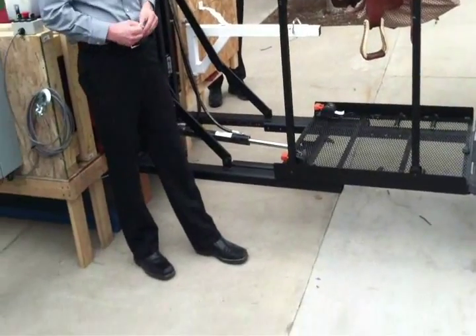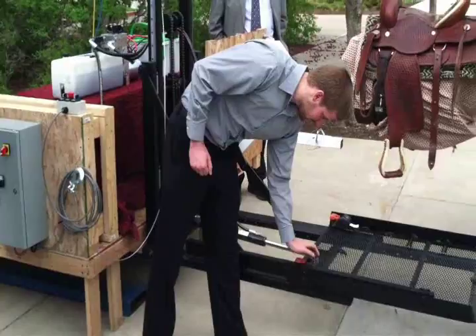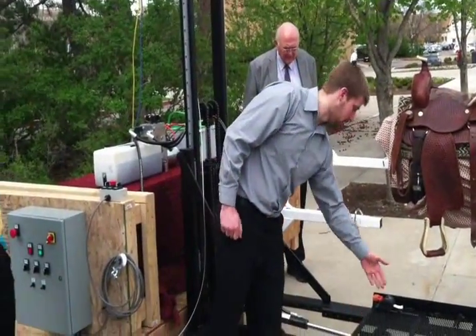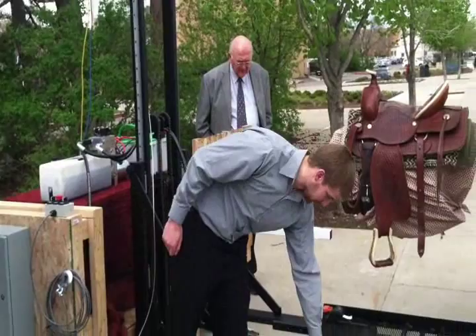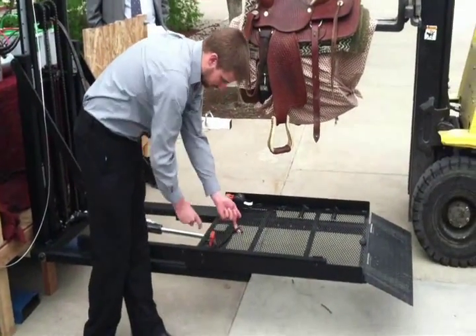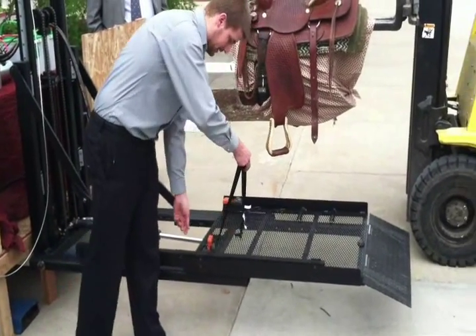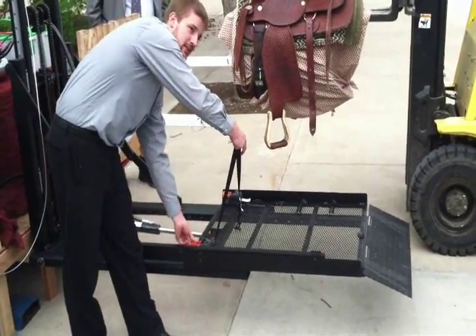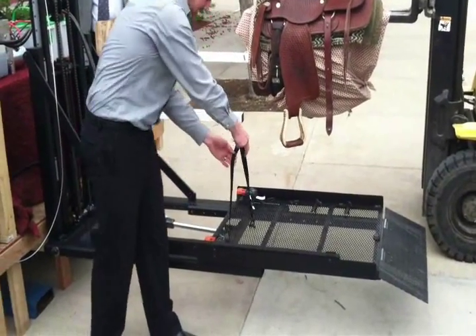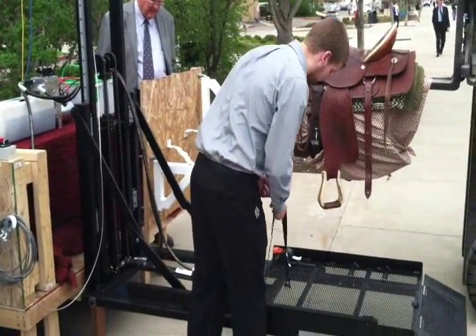Besides that, there are two safety restraints on top of the platform. Once the rider is on top of the platform, they can grab these — they release, and there are two D-rings on the platform that they can hook the hook to. They ratchet it down and that secures it, holding the wheelchair down so they are not able to move at all.